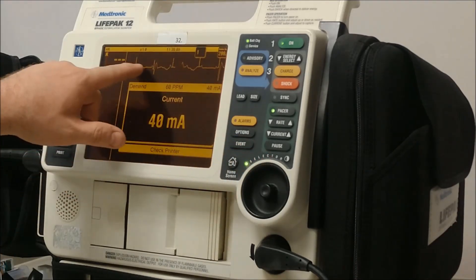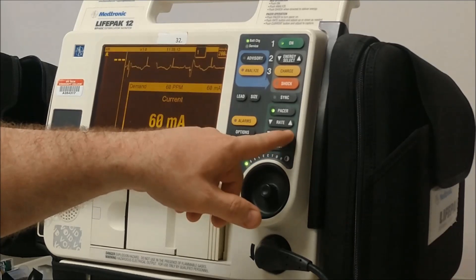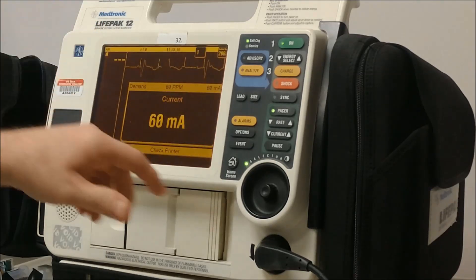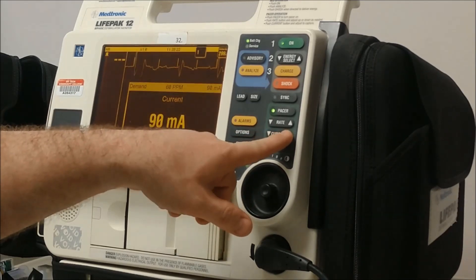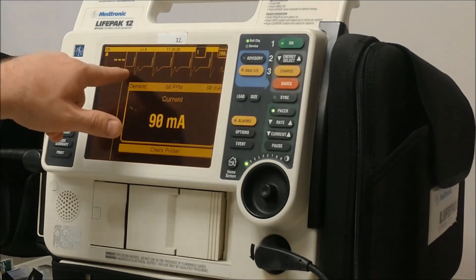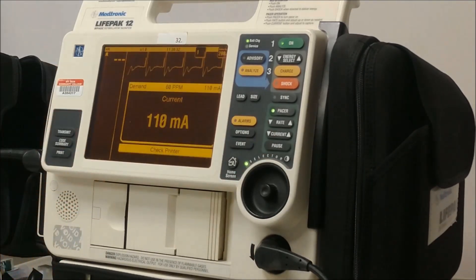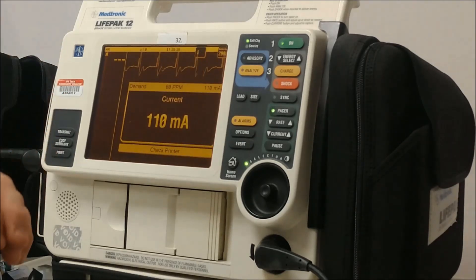Those are pacer spikes. Let's slowly increase the current. What we're looking for is after a pacer spike, a large bizarre QRS complex. It's going to be about 90 milliamps — and there we go. Right now we're pacing at a rate of 60, we have good capture. We'll increase the current by 10 to 20 milliamps to ensure that if the patient moves, we will not lose conductivity.